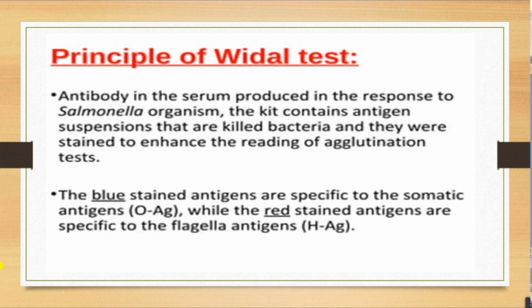The principle of the Widal test is that antibody in the serum, produced in response to infection caused by Salmonella, reacts with the antigen suspensions in the kit, which are killed bacterial suspensions. These suspensions are stained to enhance the reading of the agglutination test, because if we look for agglutination with the naked eye, the visibility may not be proper.